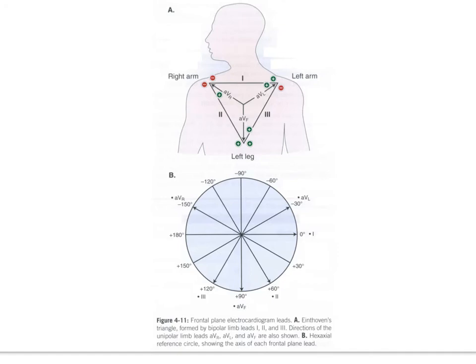So coming back to this figure and looking at the different leads we covered earlier, if there is any electrical activity going in the patient, let's say in this direction, then you can see that lead 1 would read that as a positive deflection in the ECG tracing, whereas lead AVF would interpret that electrical activity as a straight line because it's perpendicular to the electrical activity.